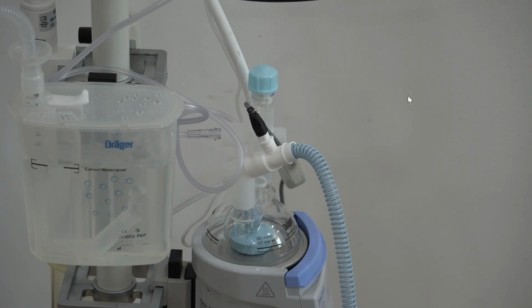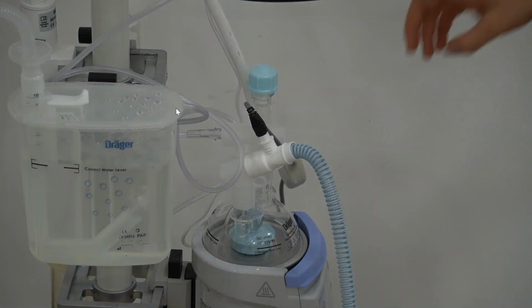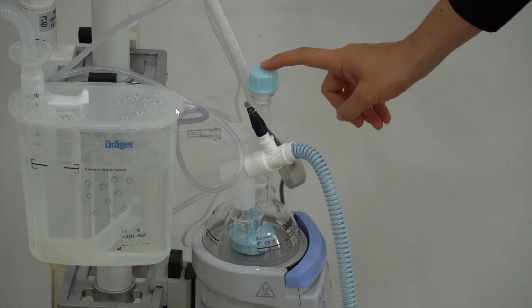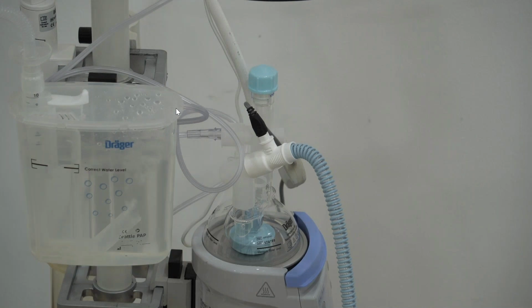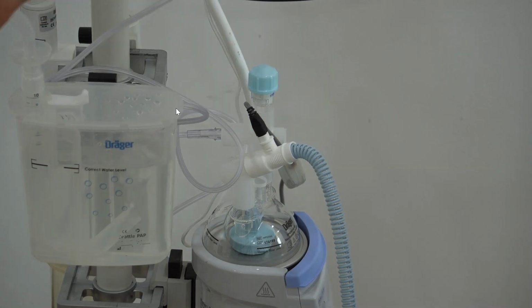Okay, so another question. Can you explain again the purpose of the blue cap container? I suppose that you refer to this blue cap, and this is the safety valve. That is probably referring back to the previous question, because there is no way to really measure the pressure in the system. There can be cases when, for example, the circuit is kinked, or the mask or the interface gets blocked, for whatever reason, and pressure is built up in the system.